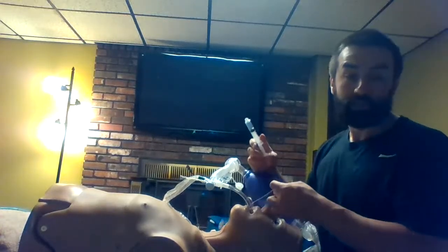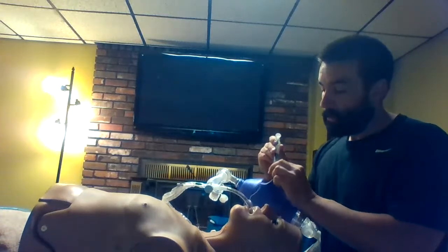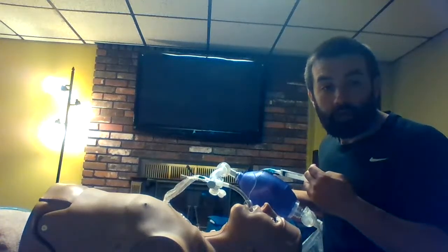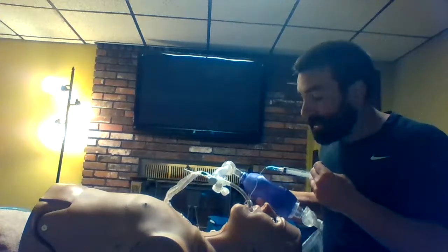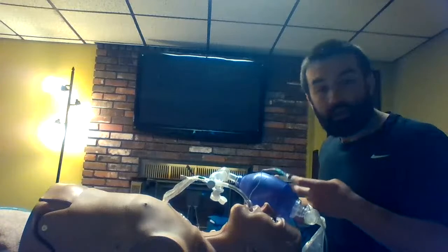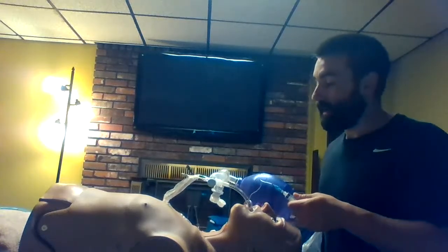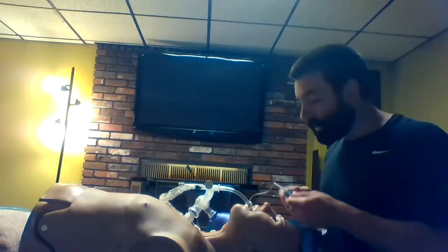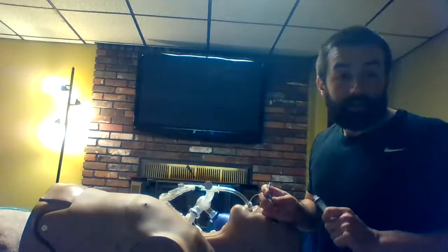I usually leave one of these in my patient's room on the back of the ventilator as well. We're going to hook up, and then while you're giving a breath, you can use a stethoscope if you want to and listen to the side of the neck. I'm going to keep advancing that air until I don't hear the leak. You notice I put a significant amount of air in, still no chest rise, still hearing the leak. At this point, we would know that's a bad situation, but let me tell you the different things that can cause this problem.